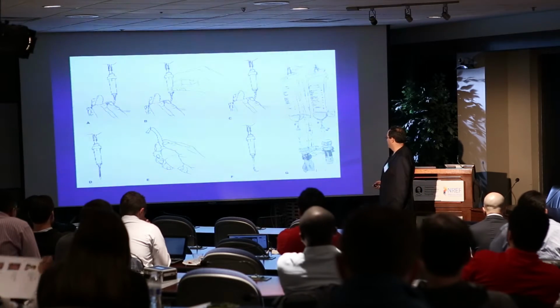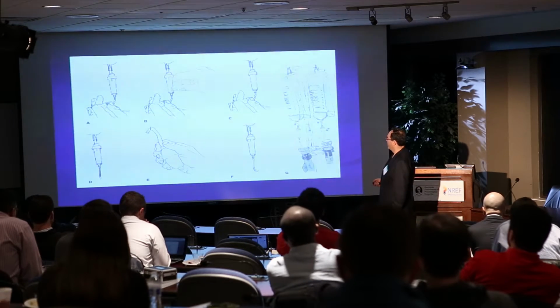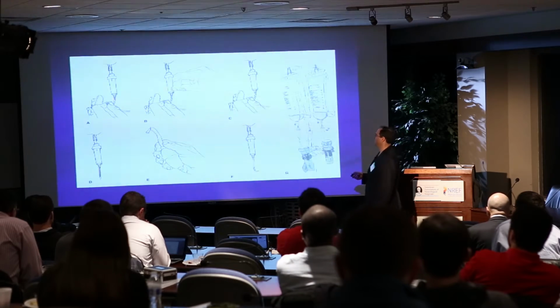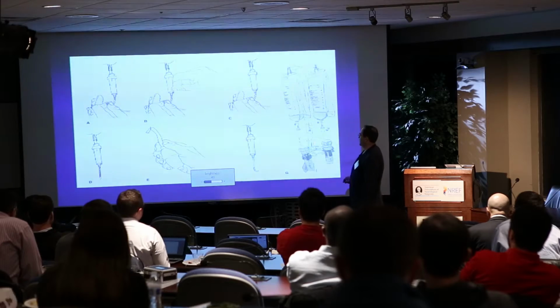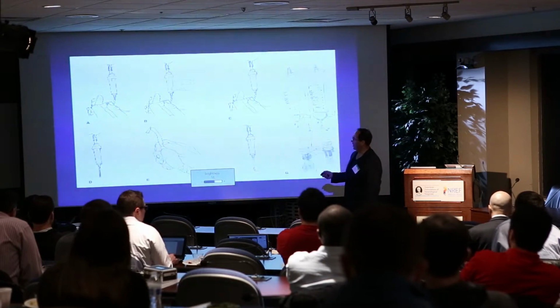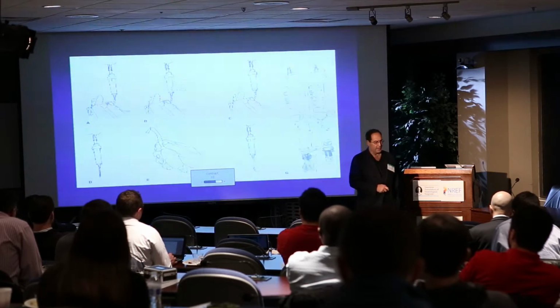Just a quick illustration that we have a reference that lists this, which Omer got these from, but really it's about creating the bubble and passing it through the line. You all have seen this before. We all use pressurized bags, most of us, and then you have to get the air out of the line. The easiest way is to create a large bubble and let it pass through the system and pick up all the bubbles on the way.